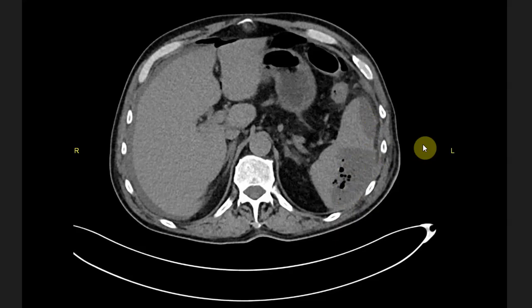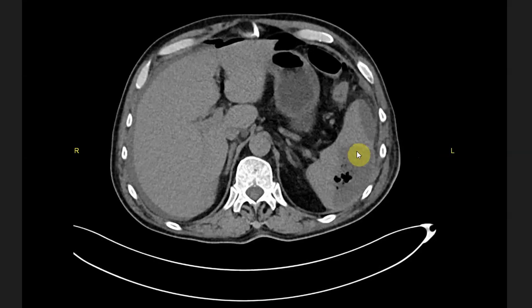On abdominal CT, it is characteristic for a splenic abscess to present as a low density lesion with or without air. If you scroll further down through the axial images, these two lesions are actually connected — and this is actually one big splenic abscess.